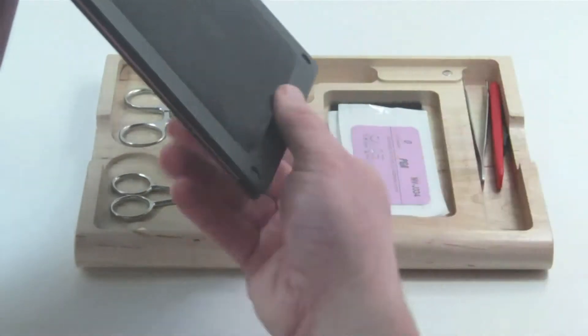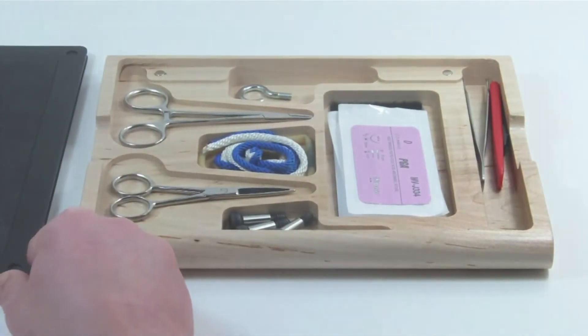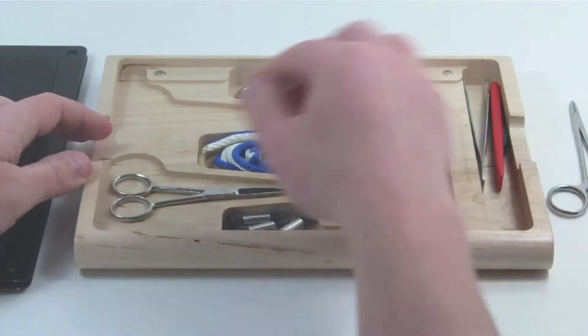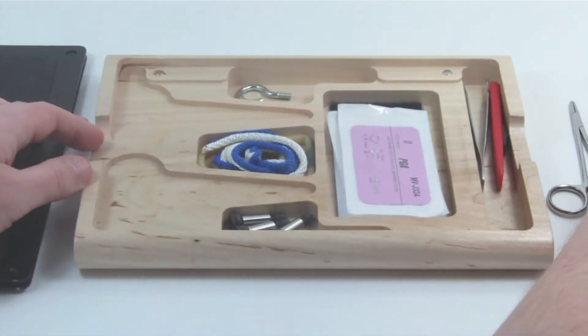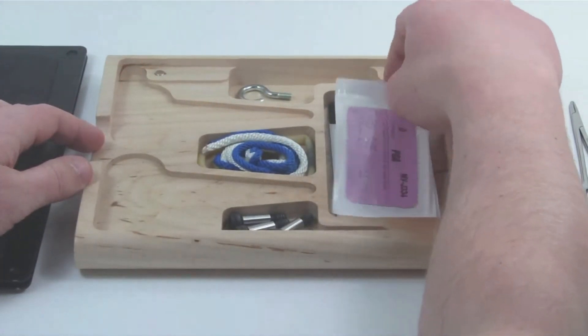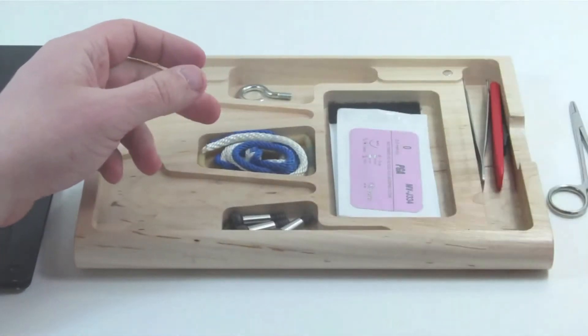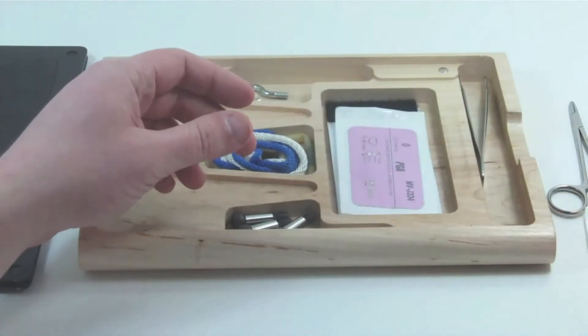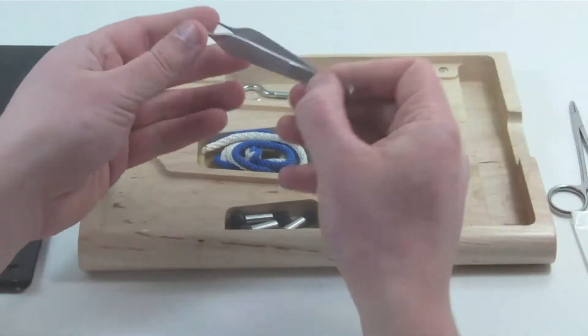Everything you need to practice suturing is contained within the sews kit. There is a needle driver, an iris scissors, sutures, a scalpel, and a pickups.